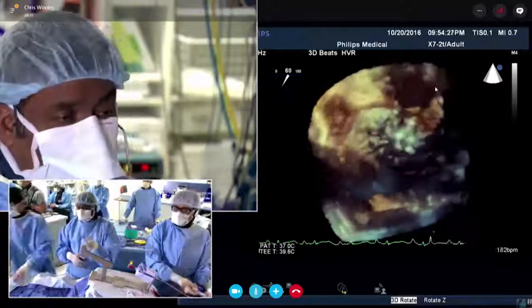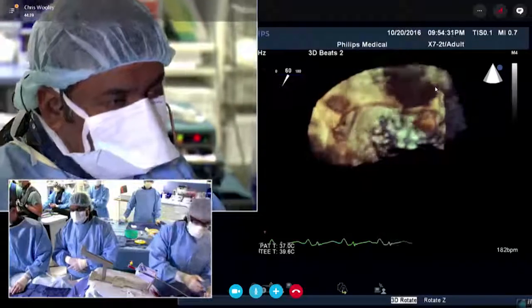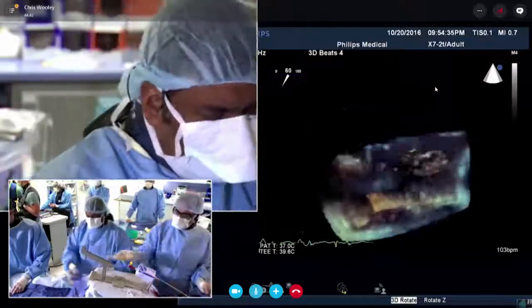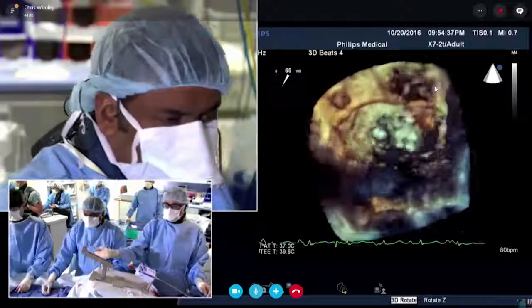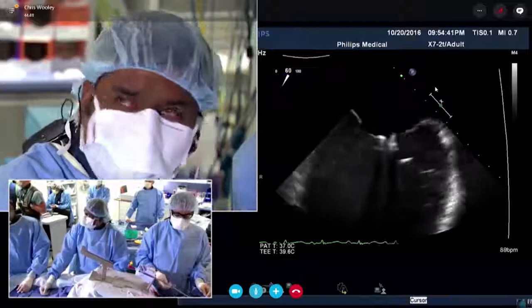So can we do cardiac outputs? Dr. Saibal, yes. Dr. Amudan here. Dr. Manthan, thank you for inviting me. You wanted to show one valve-in-valve procedure, and you can show that. Okay, we have time, sure.